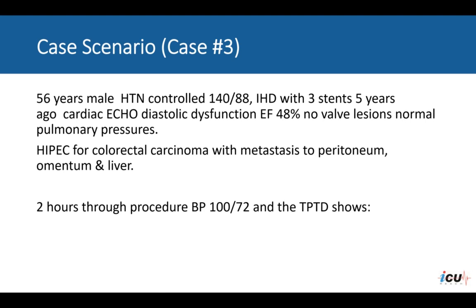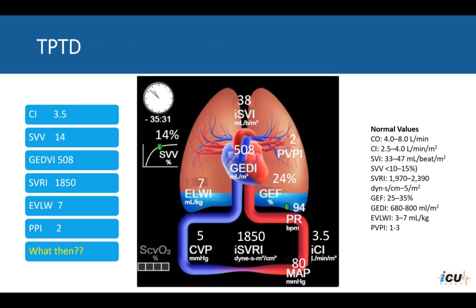And the main effect of the heated chemotherapy would be vasodilatation. So you're going to see that those patients have vasodilatation indicated by the decreased systemic vascular resistance. So this is only 2 hours after the start of the procedure, and we have these parameters.